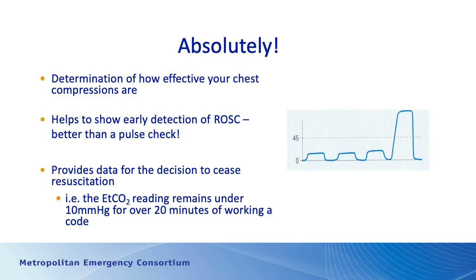In this case, the patient's going from a low end-tidal CO2 to a very high one, and that suggests two things. One is that there's return of circulation, and the other is the patient has had an increased amount of CO2 delivered to the lungs because the patient has been in arrest. So you may see a big increase in the CO2 value.